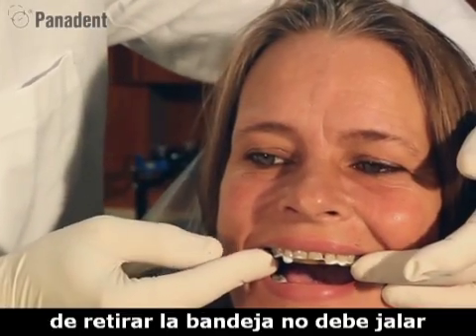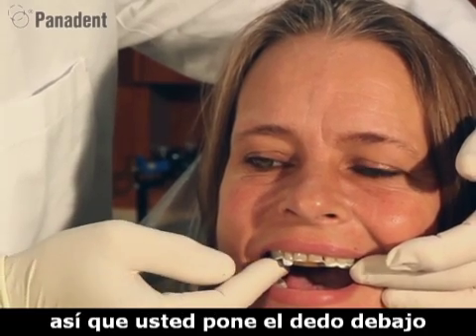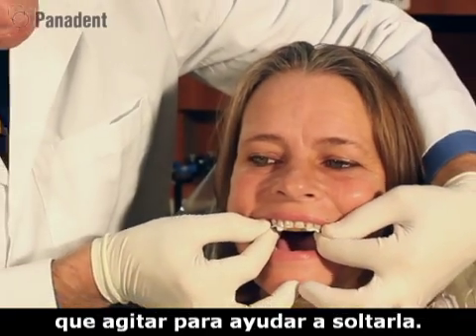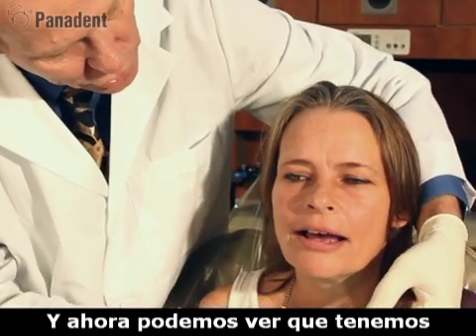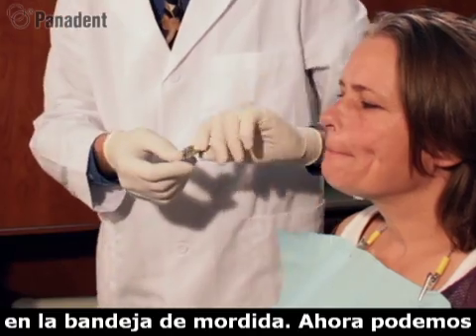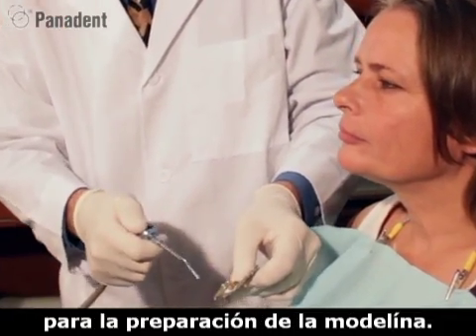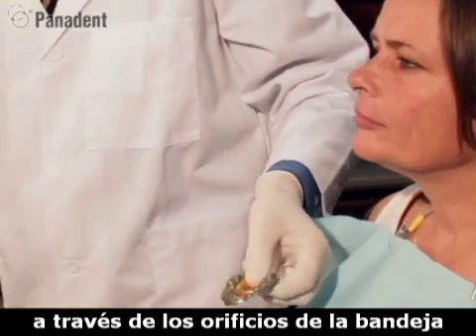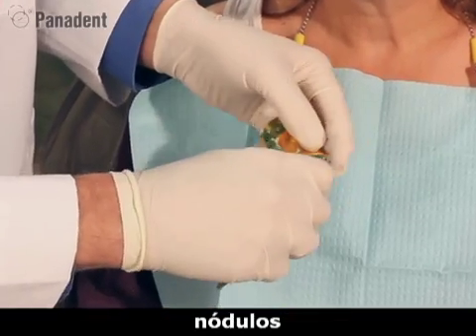And when you go to remove the tray, I don't want you just pulling down on the tray because you might warp the tray. So we like to put our finger underneath here and on the side, and then we just kind of shake, help break it loose so that now we can see we have registration of the maxillary teeth to the bite tray. We can now dry the lower side of the tray in preparation for the compound. If any material has oozed through the holes on the tray, we can take a little lab knife and cut these little nodules away.